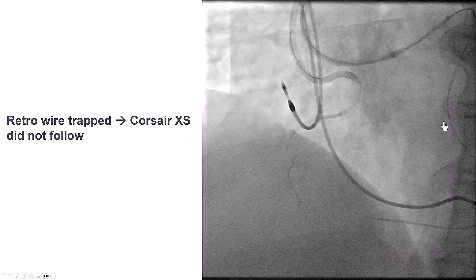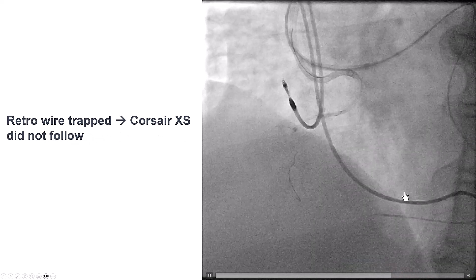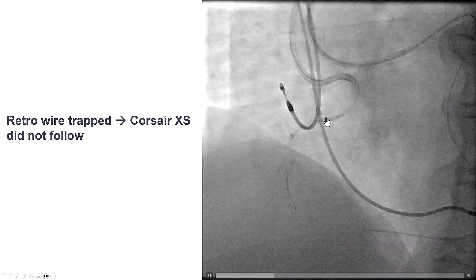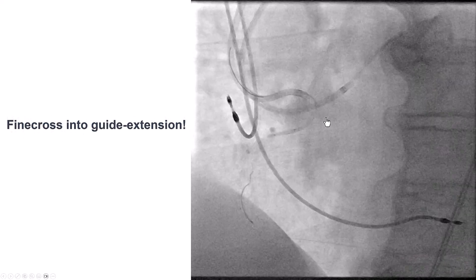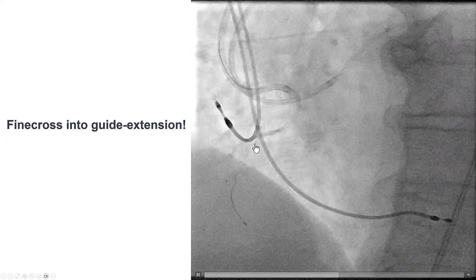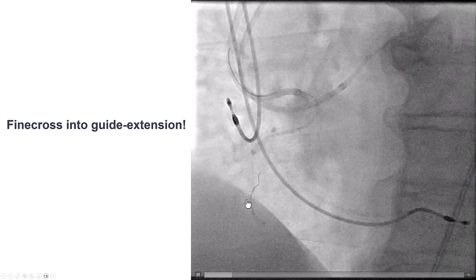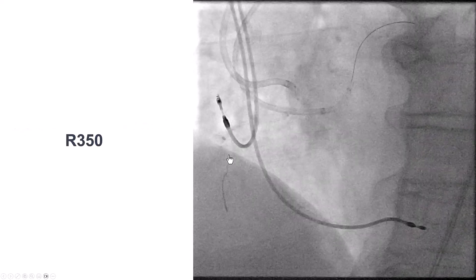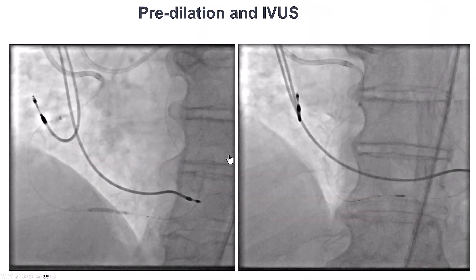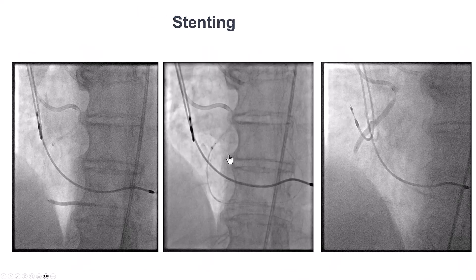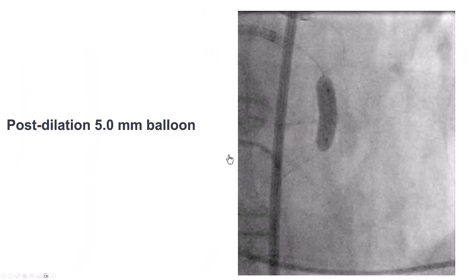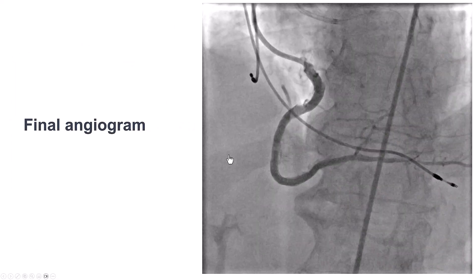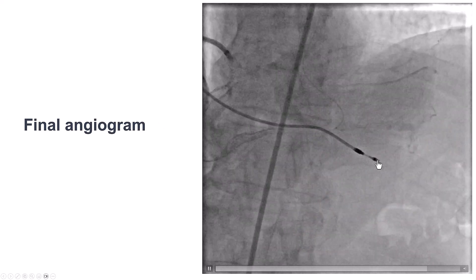We could not advance the retrograde Corsair XS inside the guide extension, so we changed the microcatheter — there may have been some microcatheter fatigue. This time, we were able to get the Finecross into the guide extension, externalized an R350 guide wire, predilated with intravascular ultrasound guidance, placed multiple overlapping drug-eluting stents that were post-dilated, and achieved a nice final result with TIMI-3 flow into the right coronary artery.